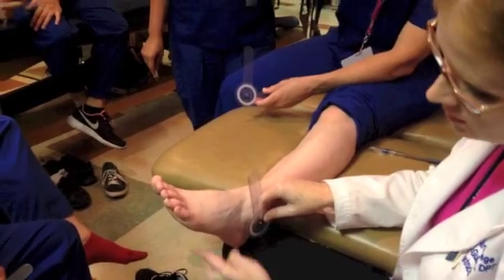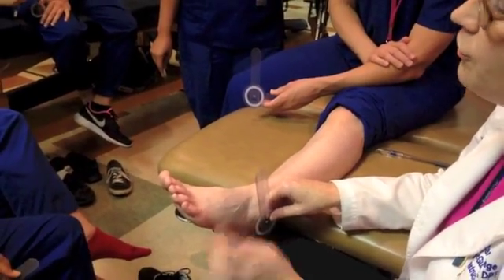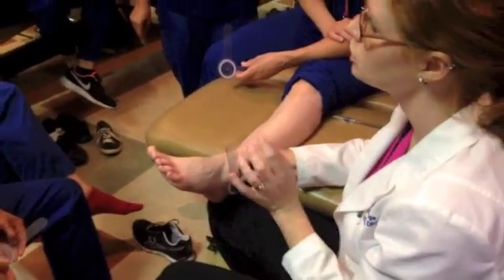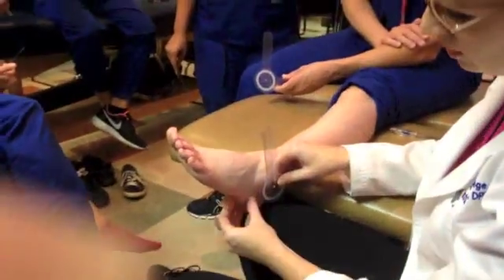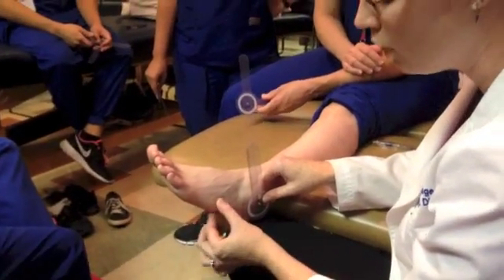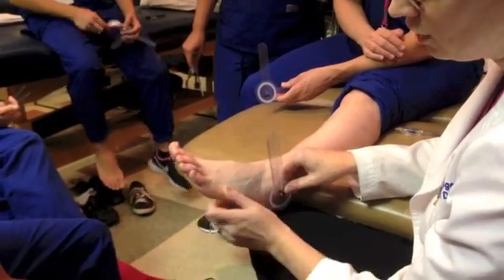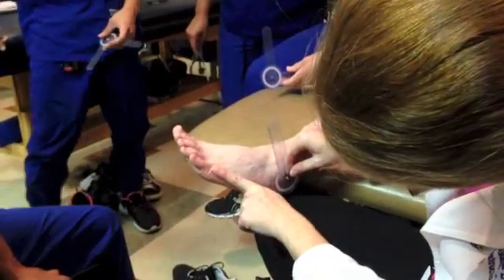The tricky part is it's very tempting to just line it up parallel to the bottom of the foot — that's not the same thing as the metatarsal, and your measurements are going to be a lot more accurate if you use the fifth metatarsal. It's easy to find that fifth metatarsal tuberosity, and then I'm going to go down from there to the fifth toe.